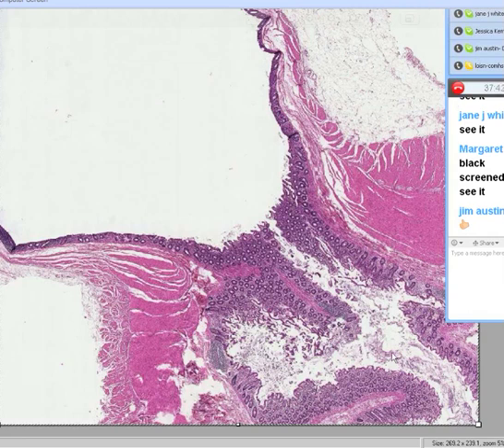So let me ask you this. Let's say that you were looking at this nice, relatively classical normal colon here, but then you saw that the lumen is actually bulging out into the fat. Oh yeah, you could still see a little bit of mucosa, but you hardly see any muscularis at all. And you can see some submucosa, and then you see some connective tissue. Anybody want to guess what this is? Or do you want me to talk you into it some more? Yeah, Margaret, very good. And Rick, yeah, you're pretty damn smart too.